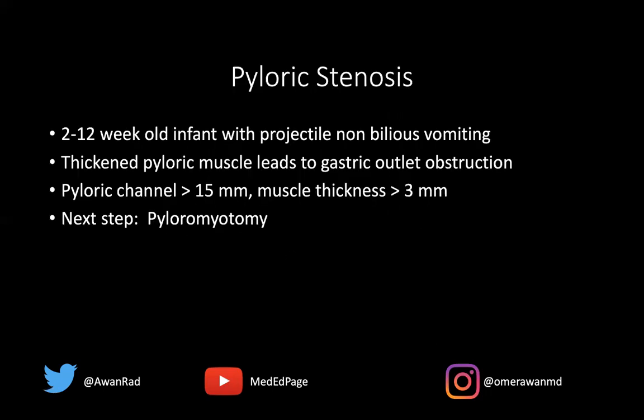2 to 12-week infant with projectile non-bilious vomiting, thickened pyloric muscle leading to gastric outlet obstruction. The next step is going to be pyloromyotomy, right? Surgery, pyloromyotomy. Nice case of idiopathic hypertrophic pyloric stenosis.